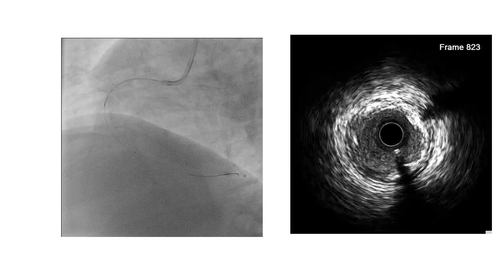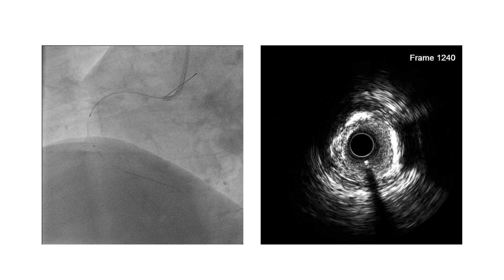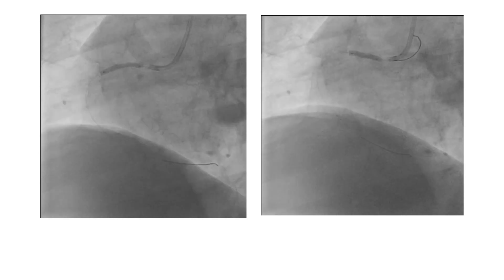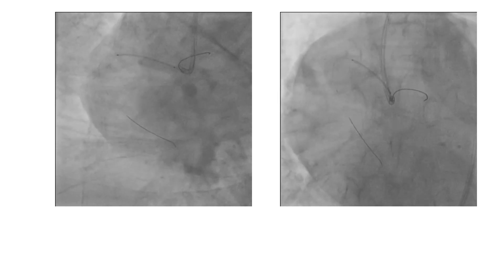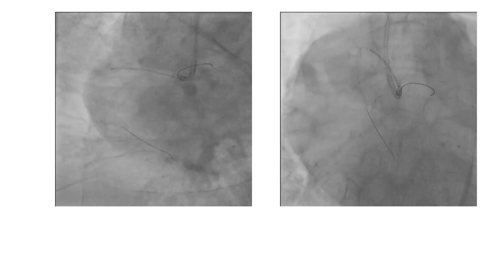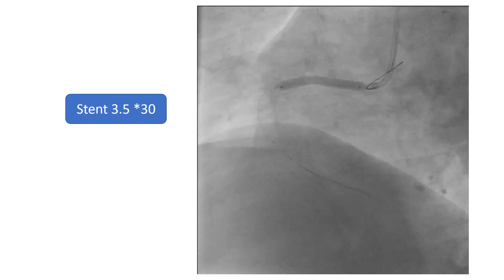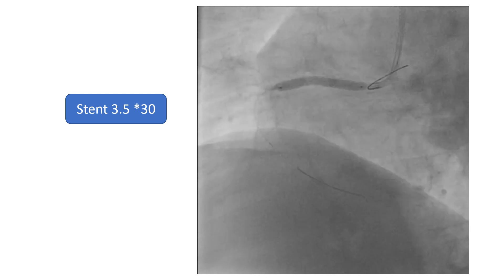Doing PCI without contrast is all about landmarks. When we did the IVUS, we chose our distal landing zone for the stent and marked that on fluoroscopy using the IVUS dot. We predilated with balloons of 2.5 and then 3.0. The difficulty was when we decided to stent from the ostium of the RCA, because landmarking was difficult, so we used a floating wire technique taking multiple views.